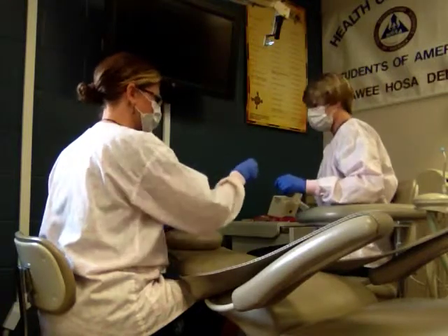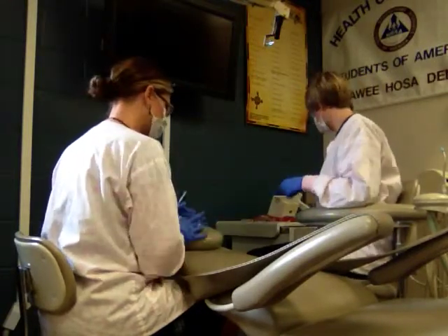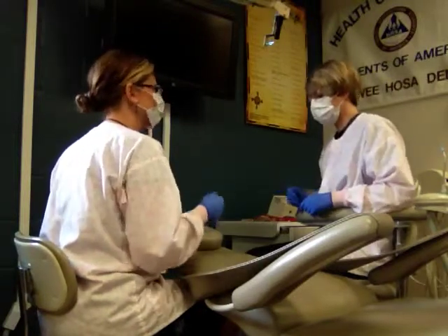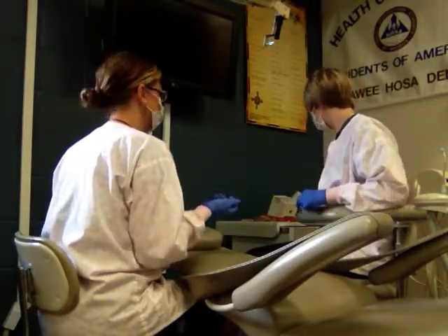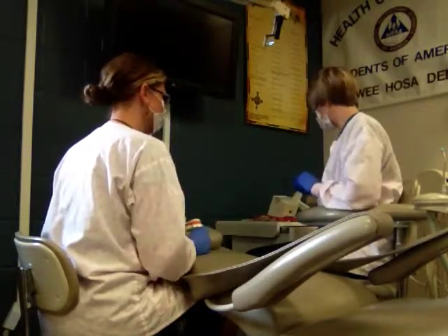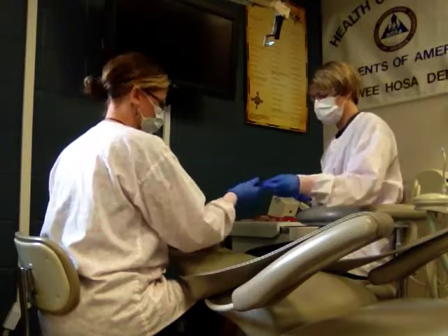Then we're going to remove the mylar strip, and now we're going to shape that tooth using the high-speed handpiece. Then we're going to check the bite. If it's high, I'll go back to the high-speed handpiece and check again.